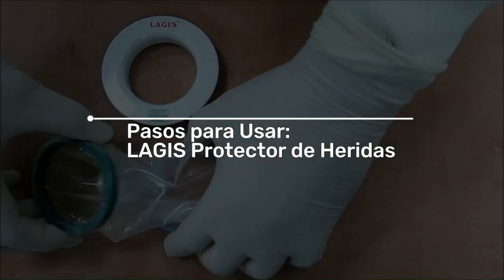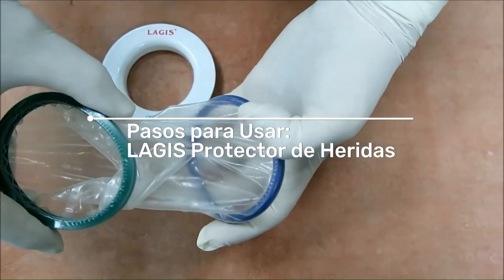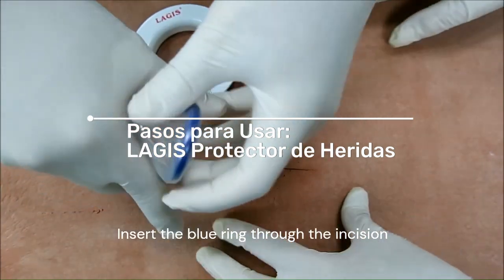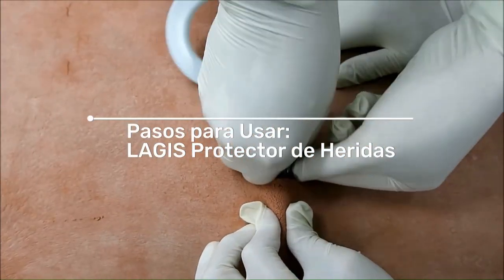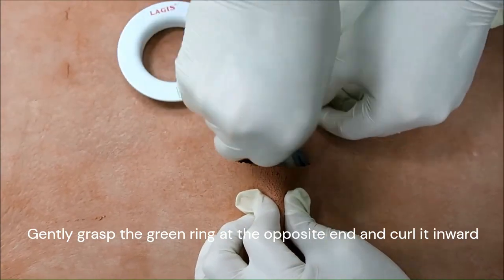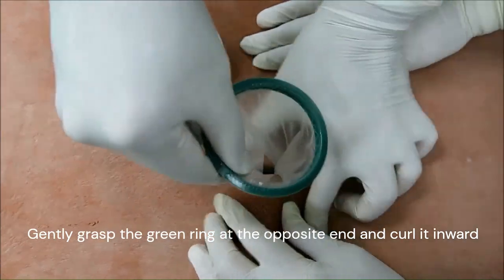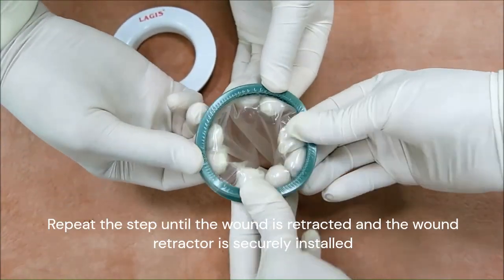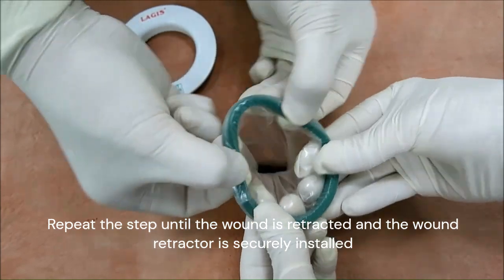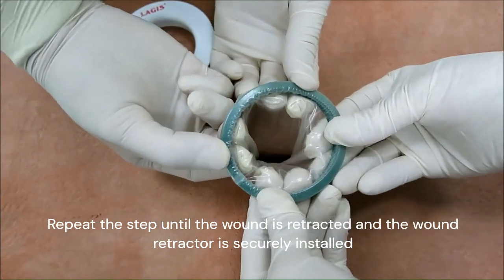LAGIS Wound Retractor. Insert the blue ring through the incision. Gently grasp the green ring at the opposite end and curl it inward. Repeat the step until the wound is retracted and the wound retractor is securely installed.